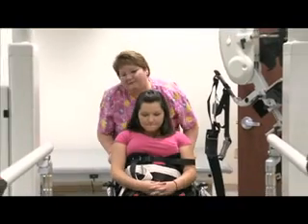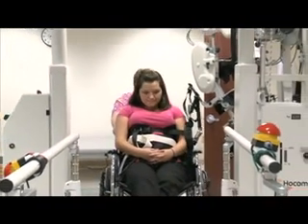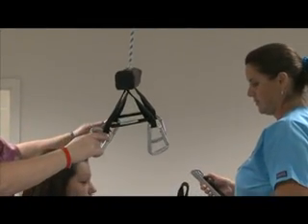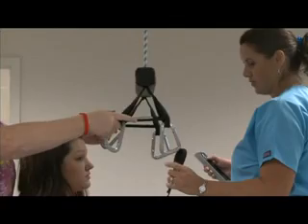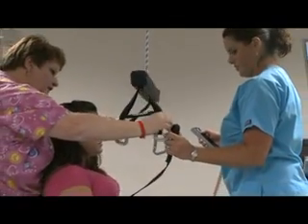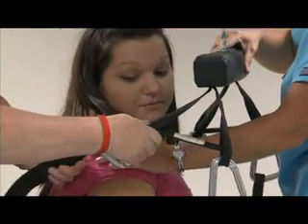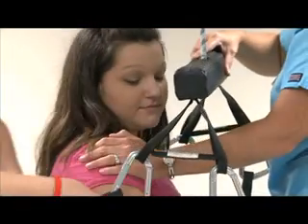If the patient is able to walk, we have an incline that goes up to our Lokomat, so we can assist them up to the Lokomat. If they cannot walk, we will put them in a wheelchair and push them up to the Lokomat. There are harness straps. Once we fit them with an appropriate belt to their size, we strap everything in. We will assess their size for the belt before we put them in the machine. We will put on the harness and straps. There's 4 straps, and we will put that on there.